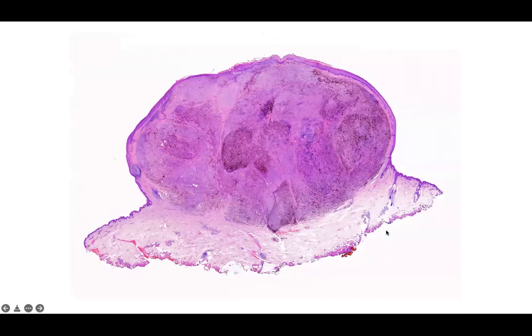So here you can see this nodular growth of atypical melanocytes. From low power, you'll be able to appreciate this expansion, and you can see an intact epidermis on top. Then you see the rete ridges over here that are still intact. And so this is most likely a nodular melanoma because of the fact that it just has a prominent downgrowth immediately. It has this kind of a collarette architecture to it.